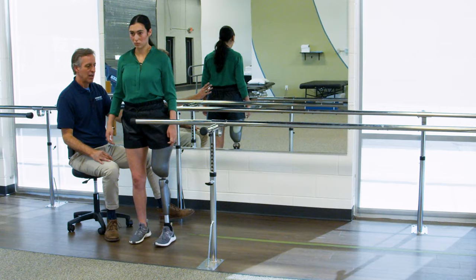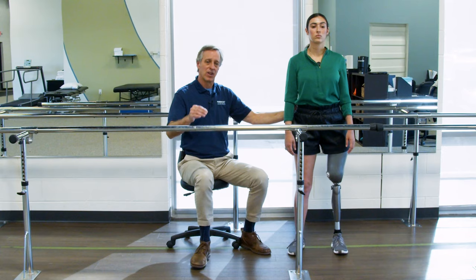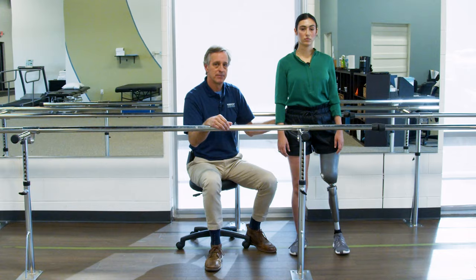Again, come back to the center. Go back to the center of the bars. That leads us in that same position that we talked about, hold right there, where we're saying, what's the most important thing? Load the prosthetic. If you load the prosthetic heavy in any drill, it's going to give you energy back and it's going to give you stability.